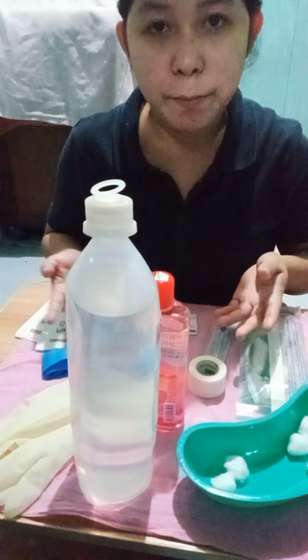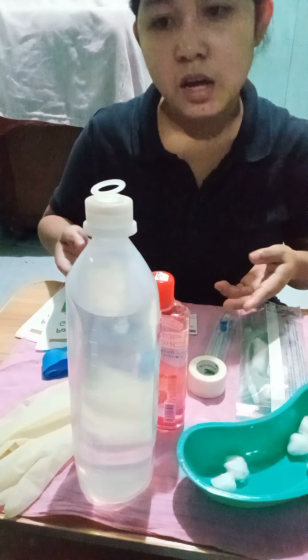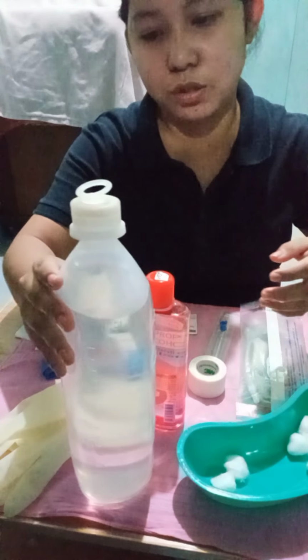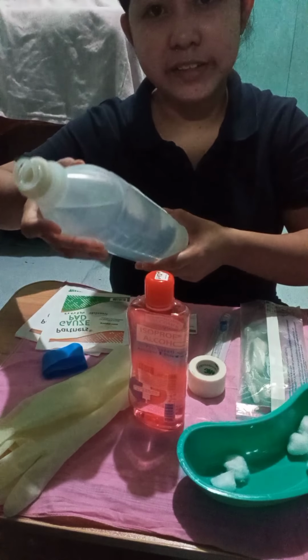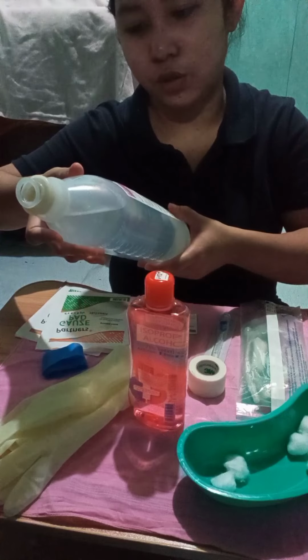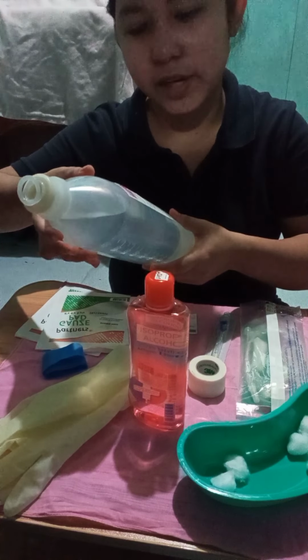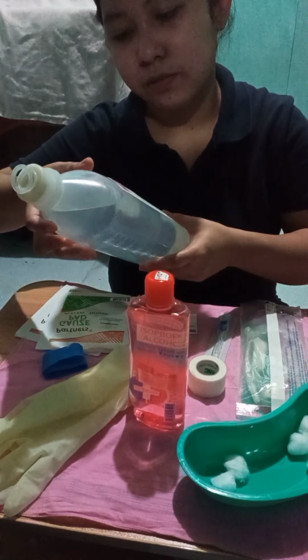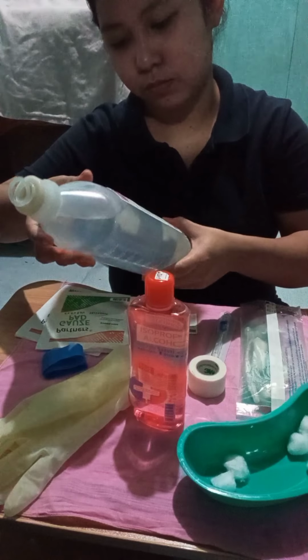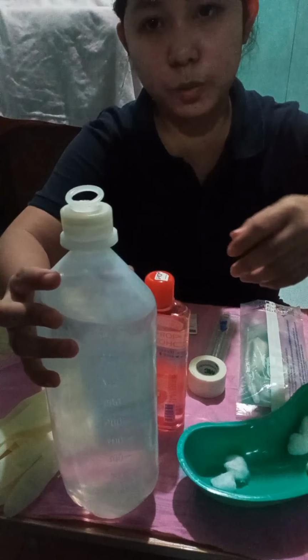So, after we open our sterile package using aseptic technique, check the IV solution regarding the right administration of the drug, if it is the right medication for our right client, and if it is the right solution. Then, open the seal.